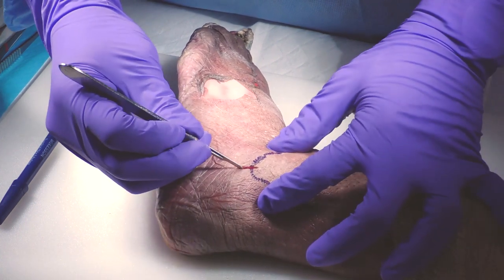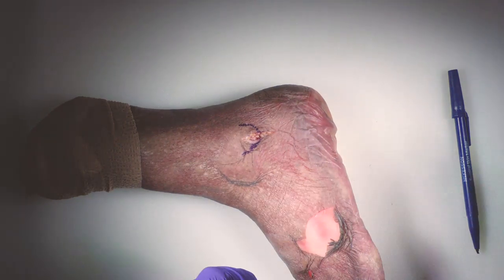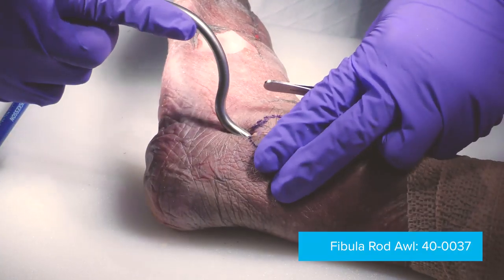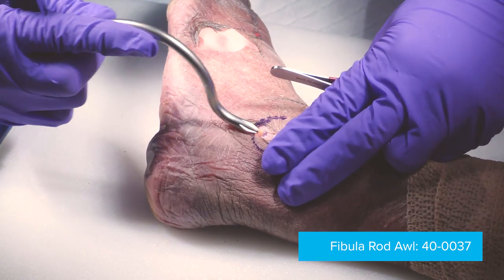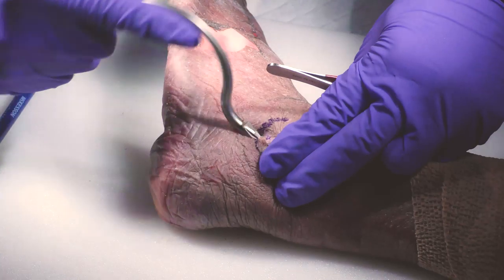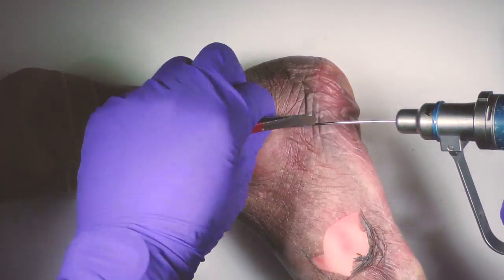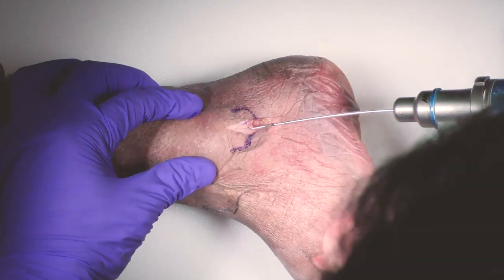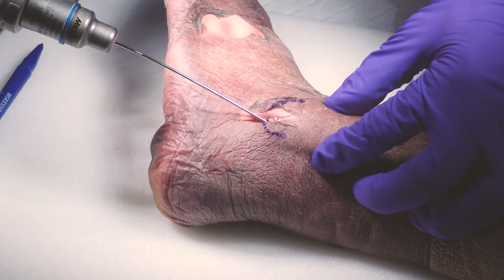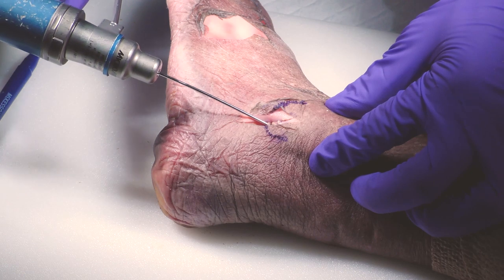So you open up this and you need to be careful with the peroneal tendons that are right there. I typically like to use this device in order to make a small entrance in the fibula, so then I can move freely around with the K wire. Now I'm aiming to get inside the metaphyseal area of the fibula. We typically do this under fluoro, but I'm going to give it a try and then we will check under fluoro. It's in the center of the fibula on the lateral view, as you can see there.